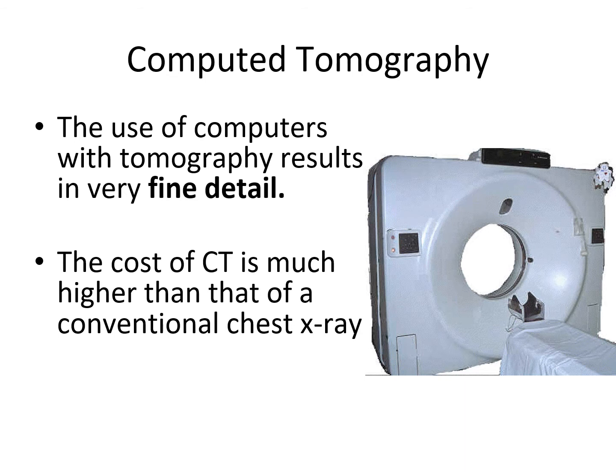They also can sometimes do it with contrast. So they inject contrast, which gives you a little bit more idea what's going on with the vessels. We do a lot of head CTs, looking at patients' heads. If they come in unresponsive, with altered mental status, they have fallen, anything like that, they will take them for a CT to make sure that they haven't had a stroke or a bleed. That's part of the stroke protocol too, when they call a stroke alert, they get them in.